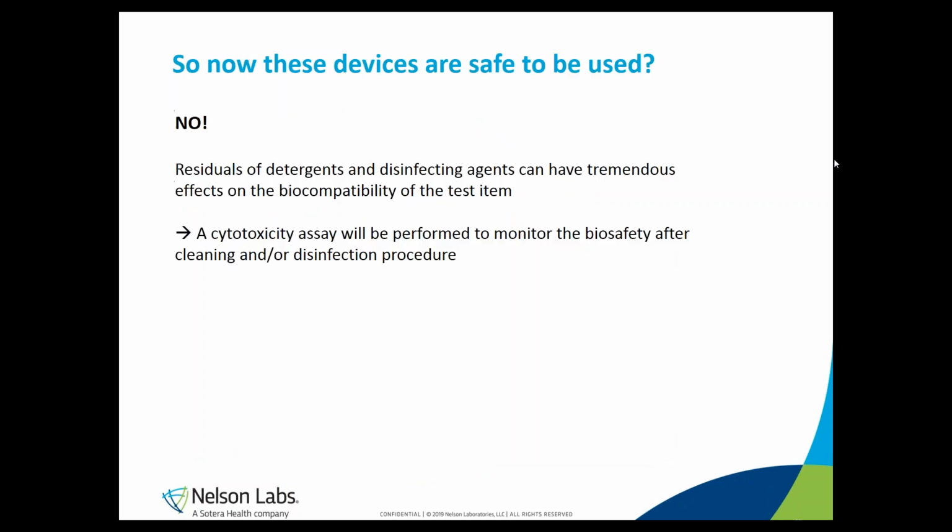There might be a potential problem that may occur with processing procedures where we use detergents and disinfectants. Residues of these chemicals may stay behind on the devices, so the biocompatibility of the processed device cannot be guaranteed anymore.